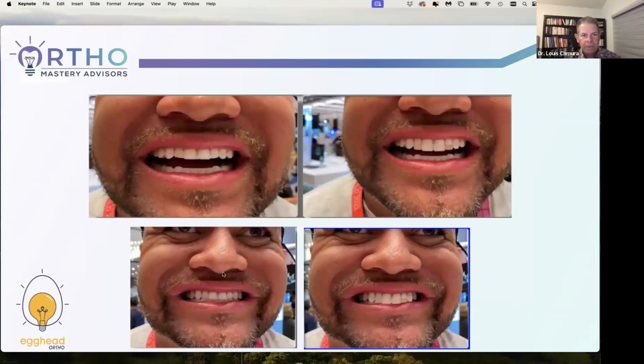And then I showed him his front teeth, and on the left are the pictures of his front teeth, top and bottom, and on the right was where I photoshopped them, okay? And said, they're too short. They should be longer so that your lower lip matches your upper arch. He couldn't even see that. These are the sort of details we should be fussing over, though, as professionals and offering. And if they do like that, then you say, all right, first we're going to fix your bite, and then we're going to fix your teeth. You can see his upper right lateral is a little discolored. I just did a reversal to do the upper left when I extended. That's why it's a different color.